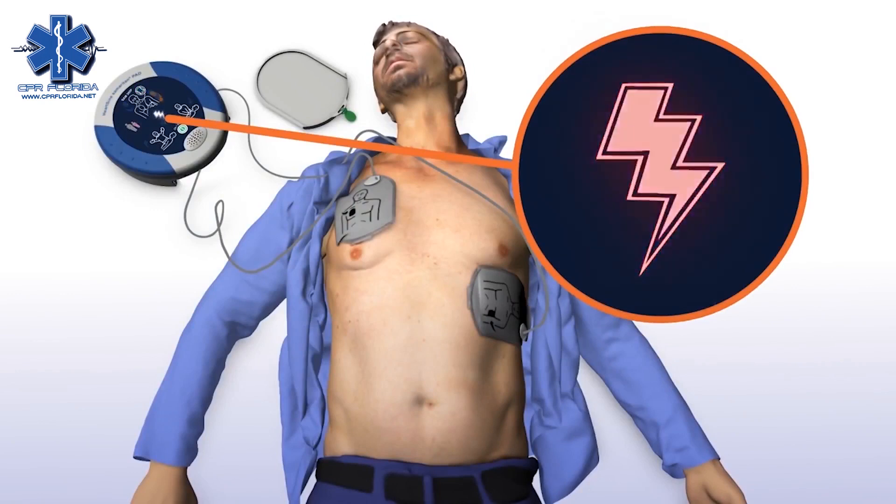Stand clear of the patient — shock advised. Stand clear of the patient; shock will be delivered in three, two, one. Shock delivered.